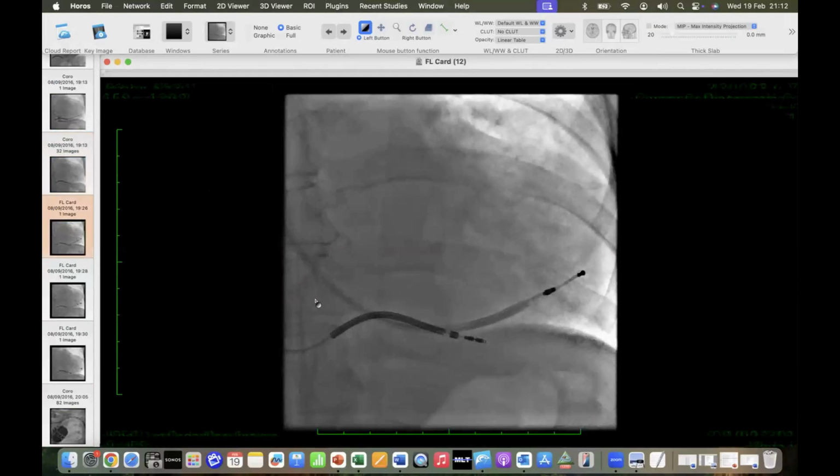In general, quadripolar leads have significant advantages over bipolar leads. The only real difference is the price and the size of the bipolar leads that allow us to get into smaller spaces when the spaces are smaller.